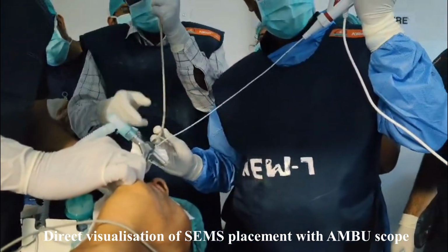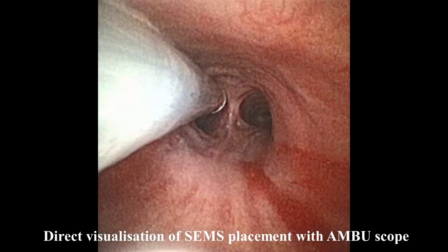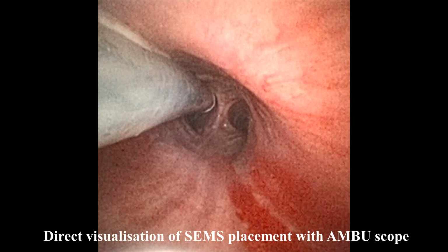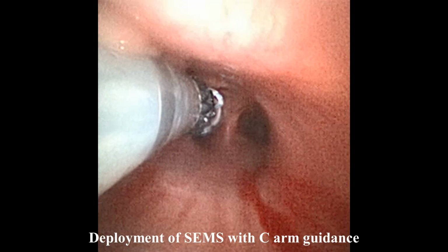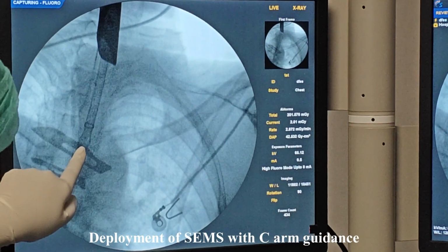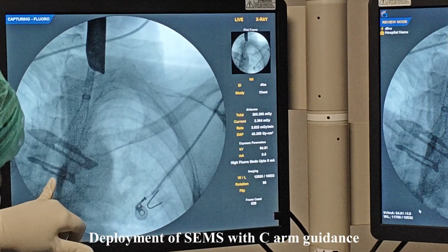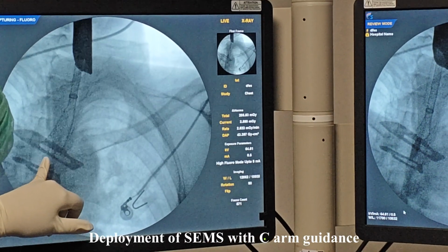I am passing my bronchoscope by the side of the stent deployer through the rigid bronchoscope, and you can see the stent deployer entering into the trachea. And once I know that I am above the carina, now I start slowly deploying the stent under the C-arm guidance. C-arm plays a very crucial role in determining the proper stent placement. So I pre-mark the carina as well as the distal margin of the deployment of the stent to make sure that the stent sits in place.